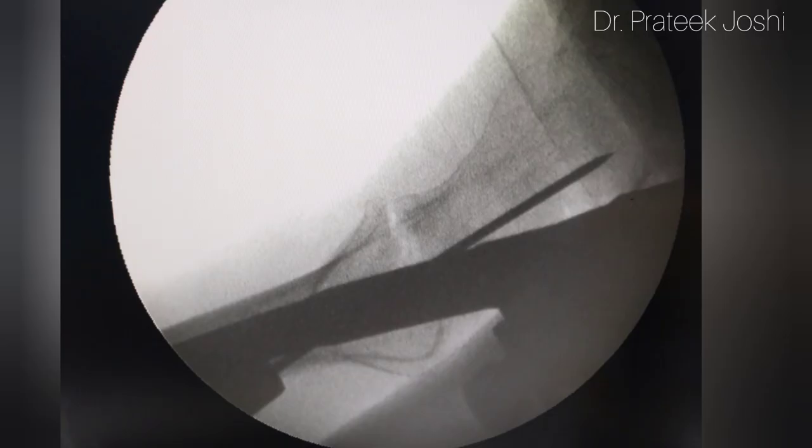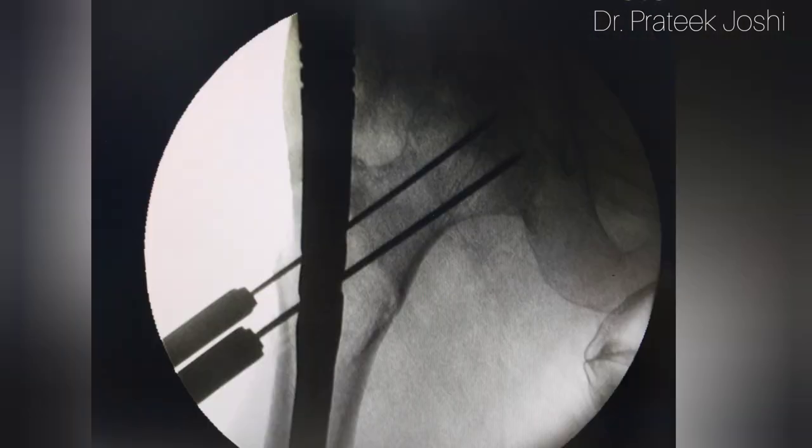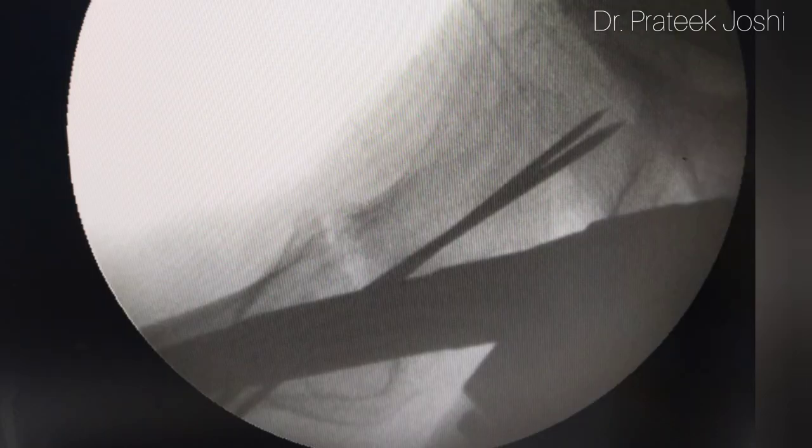The guide wire has been removed and now we are going to drill the guide wire for the 8mm and 6.4mm screws. You can see that the position of both guide wires is accurate in both AP and lateral view.